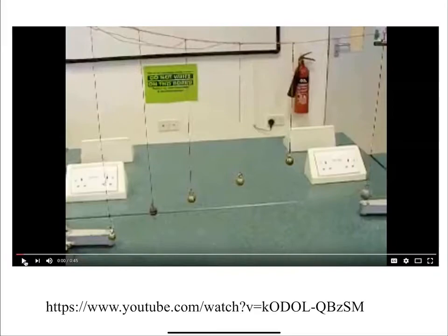So if you remember last time, we looked at this video where there were different length pendulums, and it turned out that the pendulum that had the same length as the driving pendulum is the one that was excited. Okay, and this is a really good analogy for selective excitation. So this is sort of like the gradient. In this case, the gradient is set up physically where we have different lengths of the pendulum. So there are different resonant frequencies, all right? And so only the pendulum that has the same resonant frequency as the driver is going to get excited. So it's the same principle in MR.